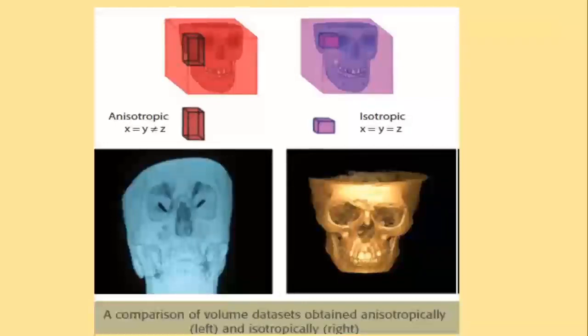A small point, just to let you know. Though there's a lot of discussion of CBCT having those typical isotropic voxels, I'm very sure some of you have already been using CBCTs, especially when you send out for implant planning. You get your reports, they tell you it's 2 mm away. When you explore, you say, hey, it's there in the canal, and these guys are telling me it's 2 mm away.